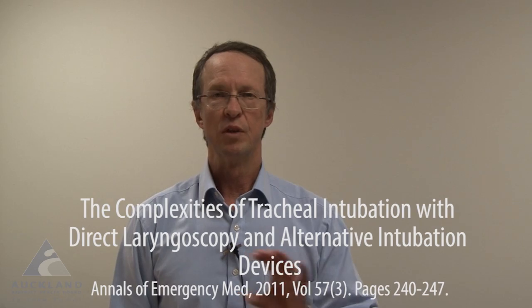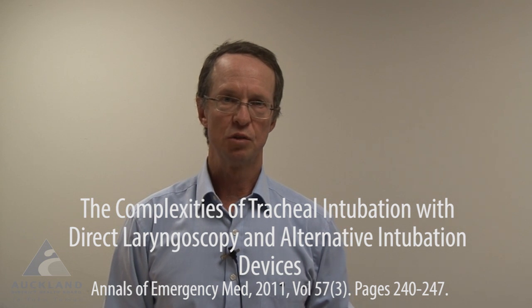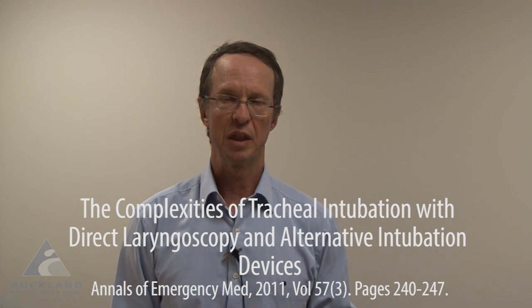Hello, this brief video is about troubleshooting video laryngoscopy. It should be seen alongside a careful read of this particular paper, which is by Dr. Richard Levitan, and the exact reference to this paper will be on your screen shortly. Dr. Levitan wrote this paper and correctly established the various issues with video laryngoscopy.